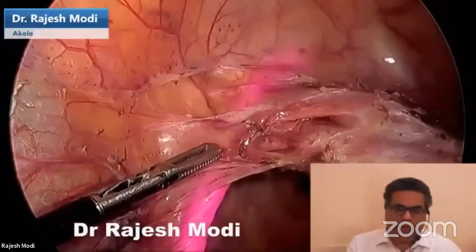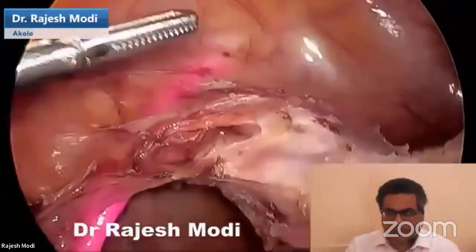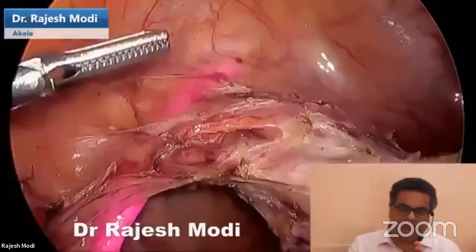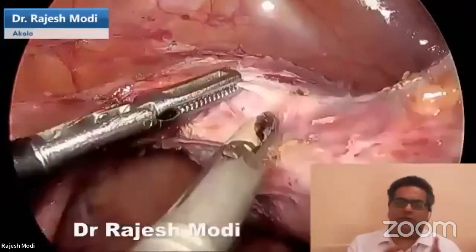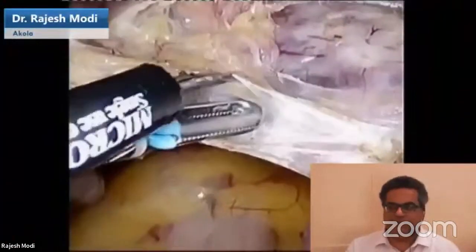So how do you know that you are not close to the ureter? You do not have to visualize the ureter every time. You do not have to dissect the ureter every time. You do not even have to check for peristalsis unless there are adhesions in that area. So do not worry about the ureter creating a problem when you are doing a simple hysterectomy.